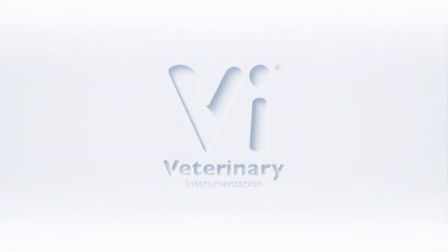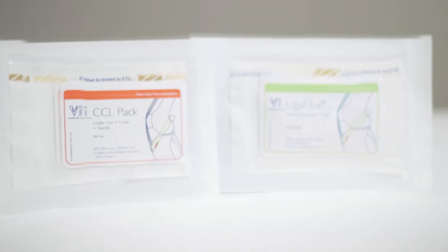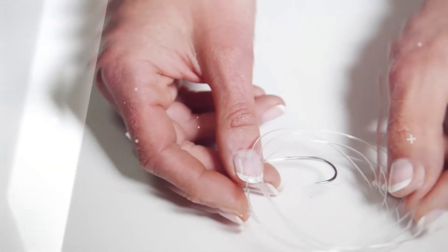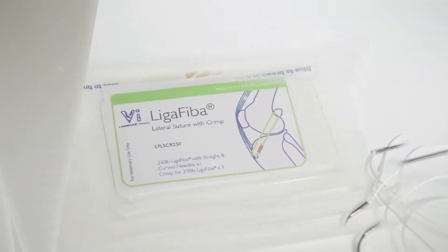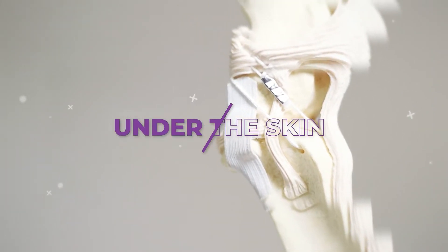Hello and welcome to Veterinary Instrumentation's latest episode of Under the Skin, a videography series introducing key devices used during orthopaedic surgery. In this episode, we will be focusing on nylon and LigaFiba. Some of the instruments used with nylon and LigaFiba will be covered in separate videos in this series. So, let's go Under the Skin.